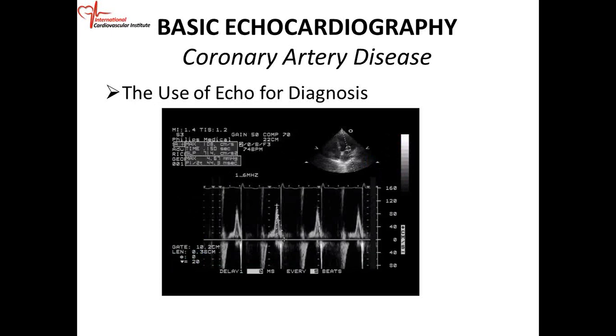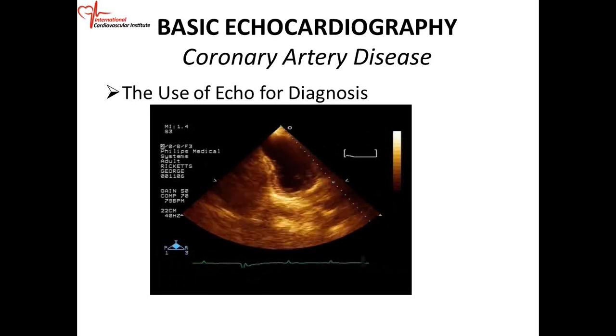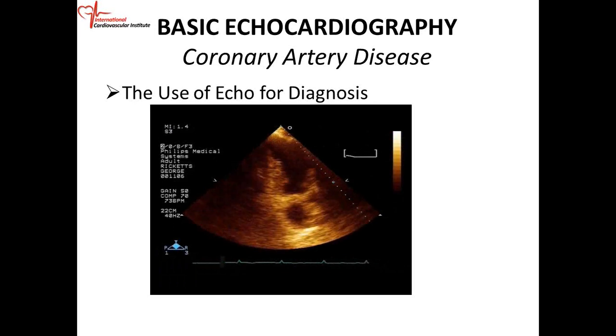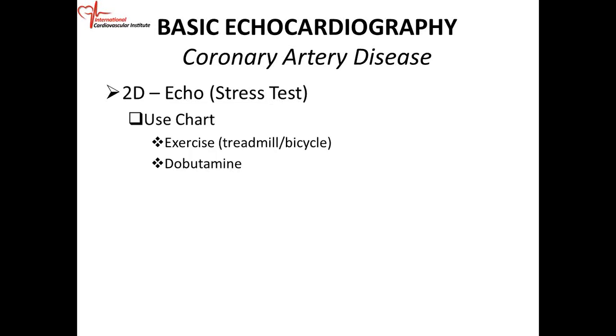If the patient has diastolic dysfunction, we can grade it by looking at your E/e', okay? And so your E to A ratio and your E/e', we can use that. Of course, you can also look at valvular lesions associated with that. So this is your two-chamber view, showing depressed LV systolic function.